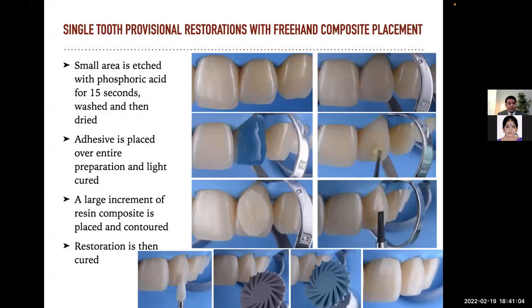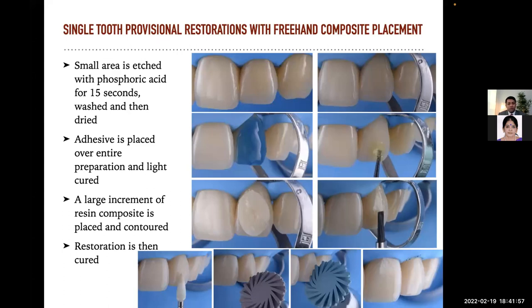For a single tooth provisional restoration with freehand composite placement: the small area is etched with phosphoric acid for 15 seconds, washed, and then dried. Adhesive is placed over the entire preparation and light cured. A large increment of resin composite is placed, contoured, and the restoration is then cured. The chief complaint of the patient in this case was improper aesthetic appearance. The lateral incisor had a three-year-old Class IV restoration. The value of the restoration was slightly lower than the tooth — the integration was good but the contact point and adhesion were compromised. The treatment plan: I chose to keep the old composite restoration in place and do a composite veneer restoration without any preparation.